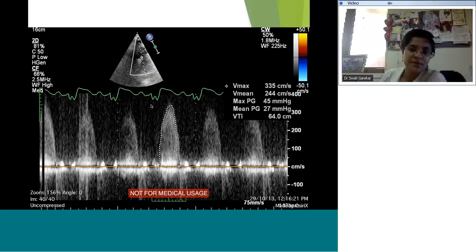Second thing is don't just rely on one parameter. Yes, this is a gray area quantification. What I call mild plus might be moderate according to you, but your defense of what you're labeling it will be strengthened if you have some quantifiable information. And not only against me, but to do justice to your patient. Serially, when you see the patient, you yourself will be stronger, however you choose to label it.